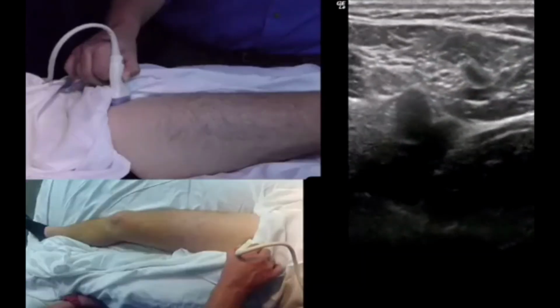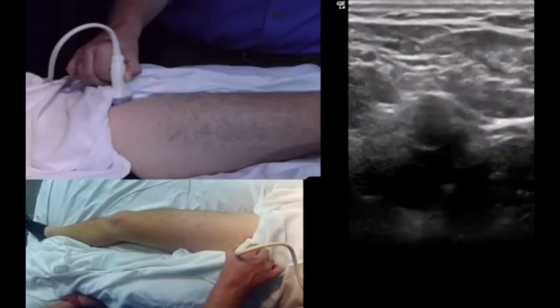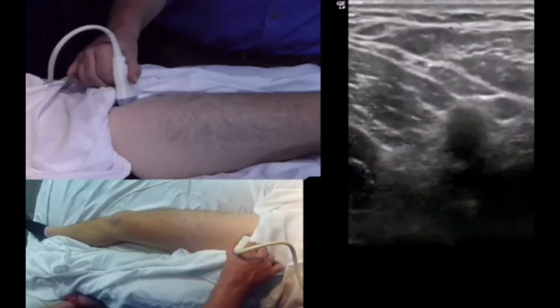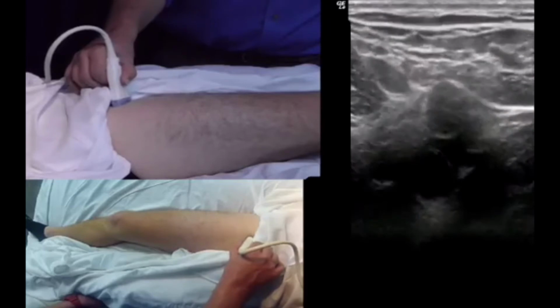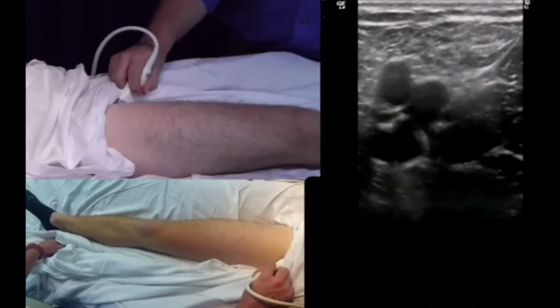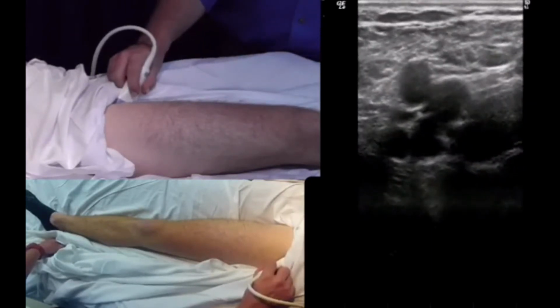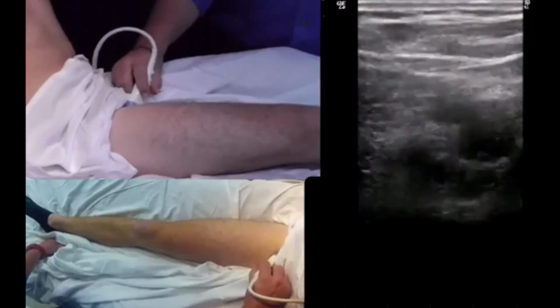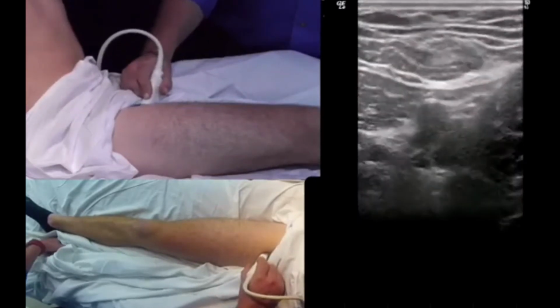Once you're satisfied that the common femoral vein at the confluence with the greater saphenous vein is fully collapsible, you'll slide down to the confluence between the superficial and deep femoral vein. If you're having difficulty identifying the anatomy, oftentimes it's because the subject is lying flat and there's low luminal filling pressures in the venous system. So you can have the subject sit up. This will provide impedance to forward flow in the venous system, and this will cause the veins to dilate. And obviously it'll be a lot easier to visualize.